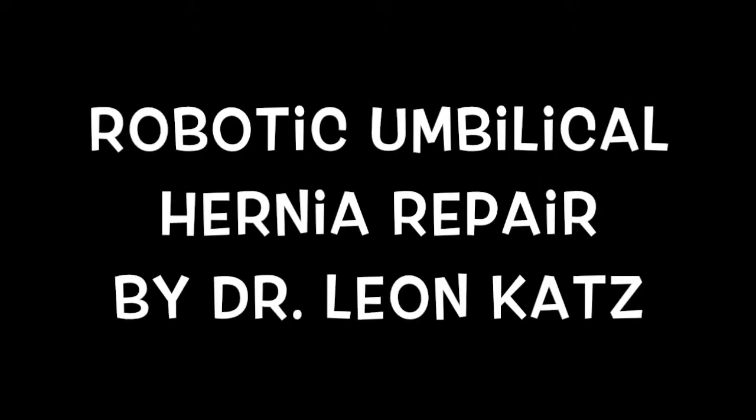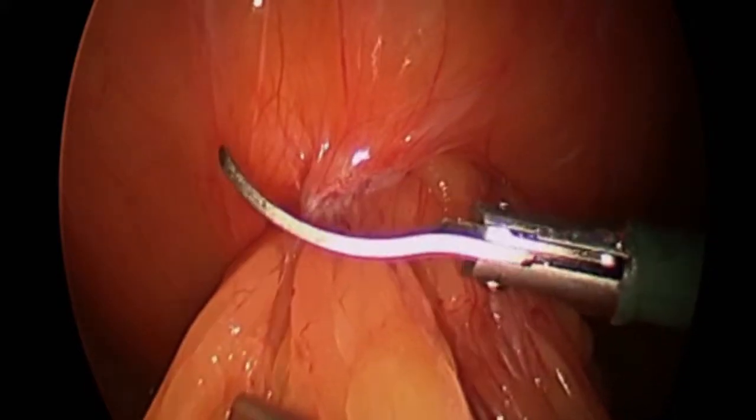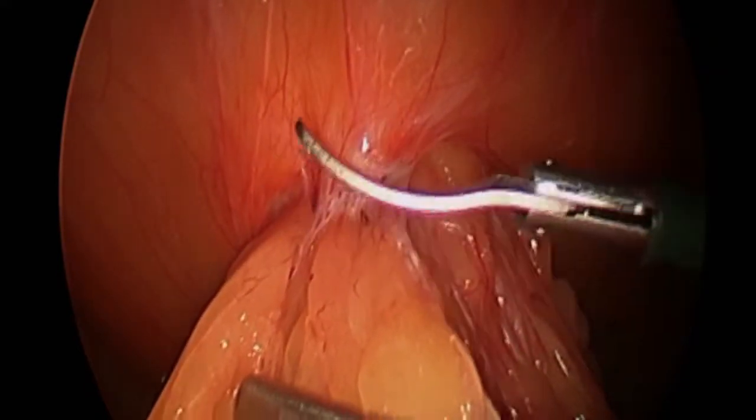This is a video demonstrating the use of the robotic platform for repair of an umbilical and a ventral hernia.